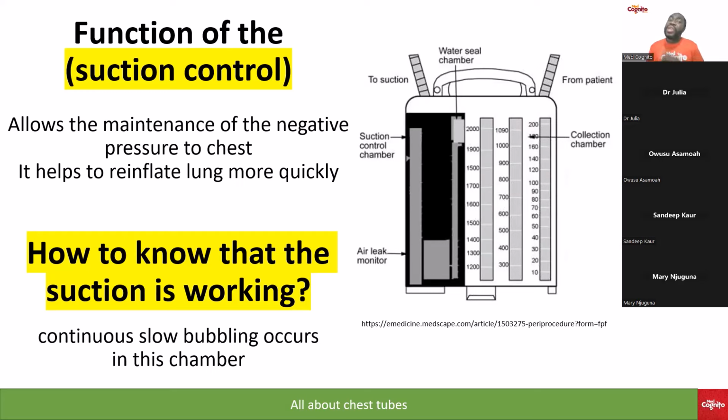So how will I know that the suction is working? The way I will know that the suction is working is that I will see bubbling in the suction pump, the suction part. That is what is going to help me to know that, oh, okay, the suction is working.